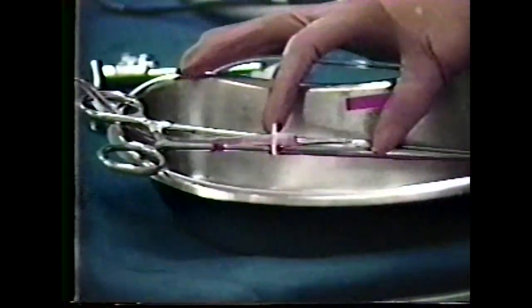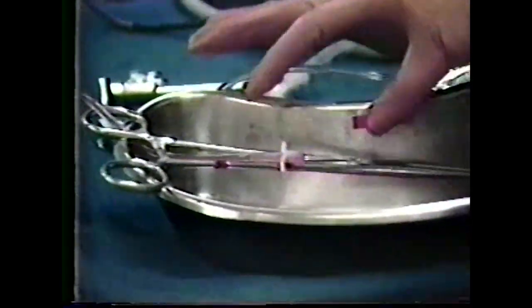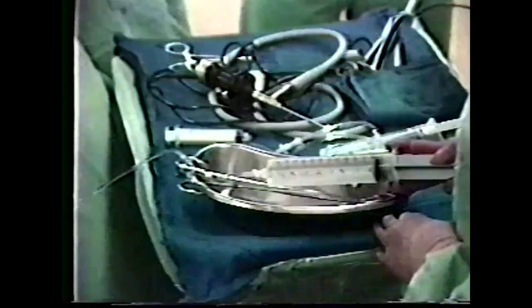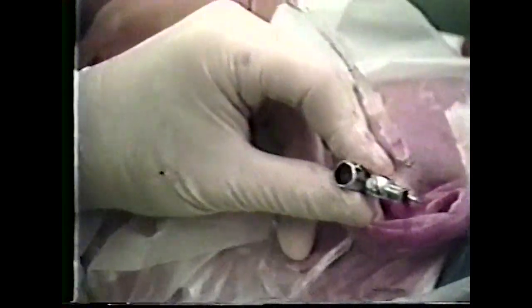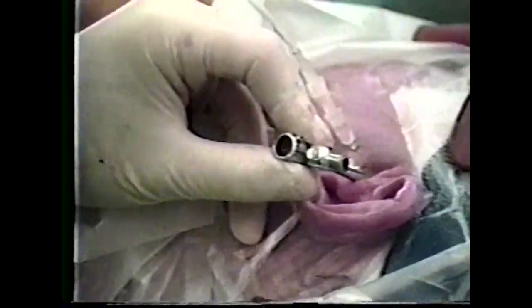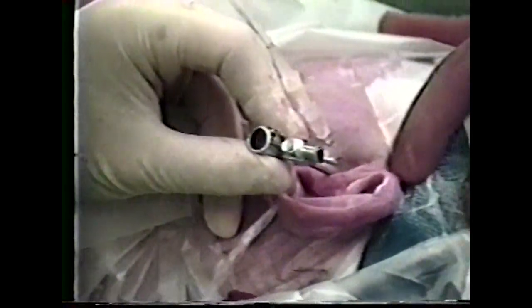Be sure the tip of the outflow tubing is held up off of the bottom of the basin, flush until the drainage is clear. The 15-degree arthroscopic cannula is now placed at the infralateral portal. Continuous distension of the superior joint space is accomplished by connecting a 60 cc syringe to the outflow tubing temporarily to provide constant pressure. After puncture, drainage from the scope cannula confirms that it has entered the TM joint space.